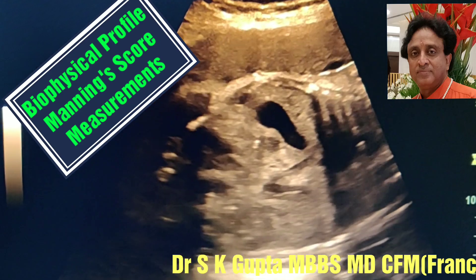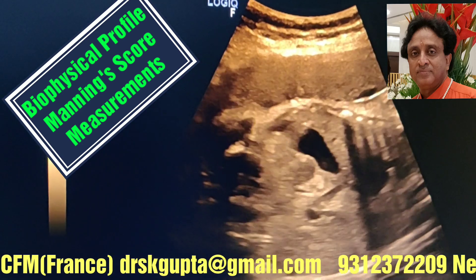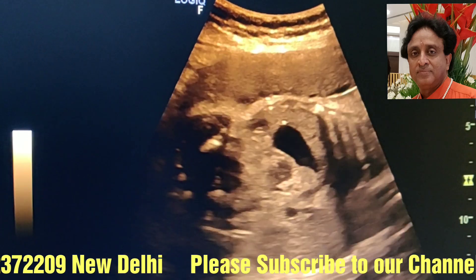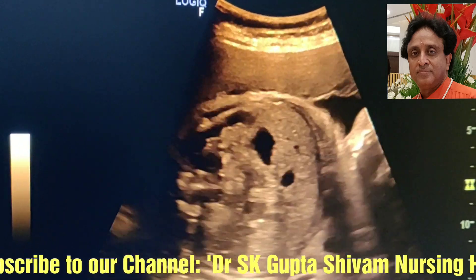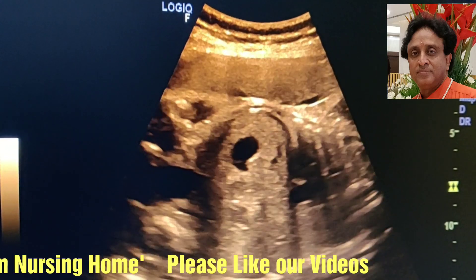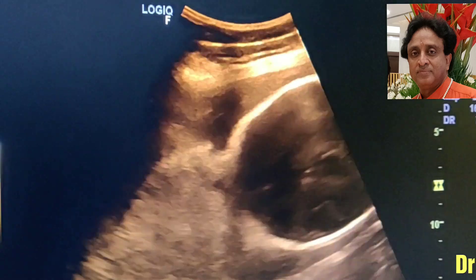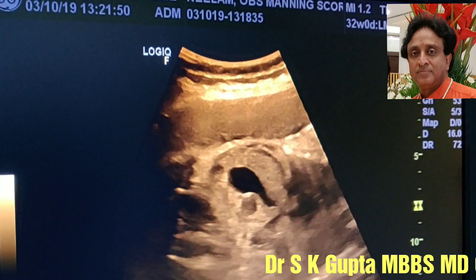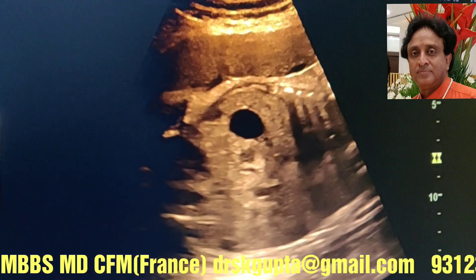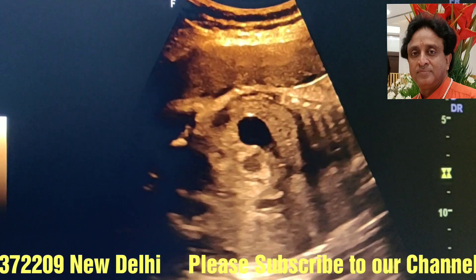Today I am going to demonstrate how we perform the biophysical profile score measurement, or the Manning score measurement, during ultrasound examination. The Manning score is required by the gynecologist and obstetrician during the term phase of pregnancy, and they basically want to know whether the Manning score is low so that they can take up the patient for emergency cesarean section.